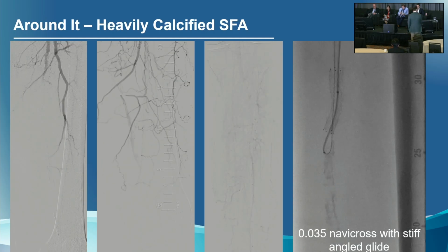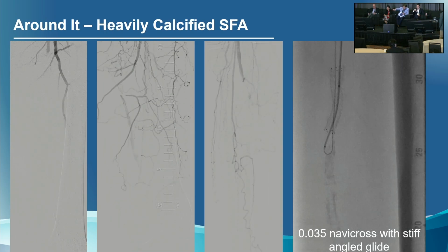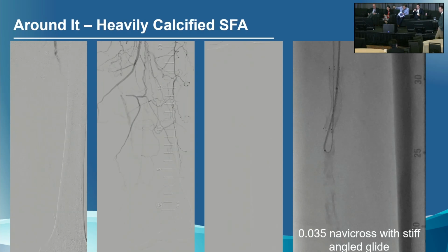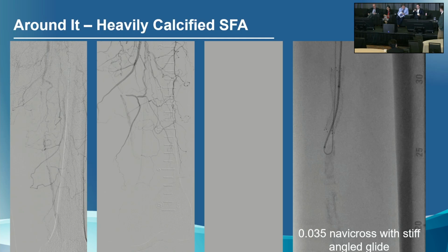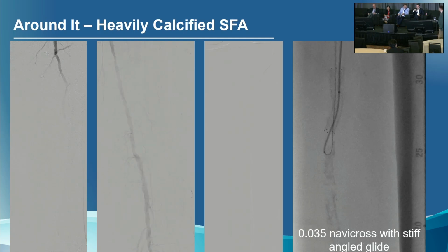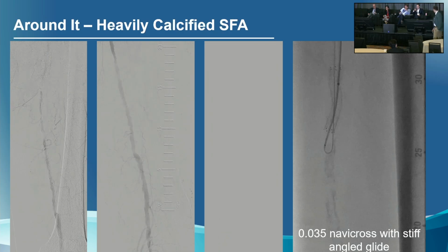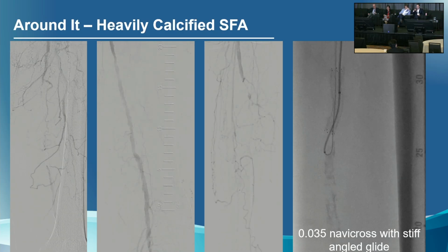So Zach, what do you think there? You're digging in the same spot, but if you look, your loop is pretty big, right? You're in the stent, it looks like, but the loop of the wire is way up towards the top of the screen and off the top of the screen. Is it worth just pulling your catheter, redirecting it, and trying some more? I can tell you I tried all that. Did you switch to a straight? Yep, I used a straight tip Glide just to try to burrow in. Okay.